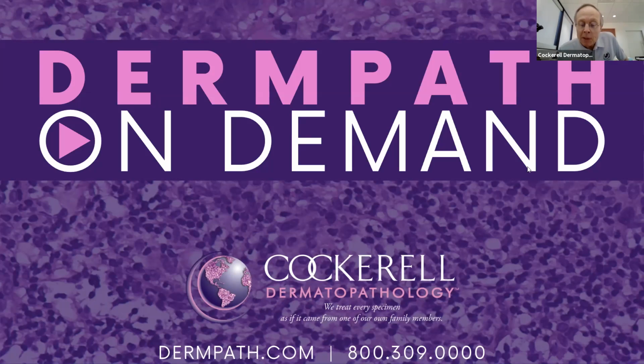skill, if you will, because you're going to be faced with a series of unknown slides on the board examination where they're going to expect you to be able to look at a slide, in some cases make a definitive diagnosis pretty quickly, and then answer a second order question. There'll also be slides where you're given a whole list of digital slides to look at, images, and then you need to just choose an answer.